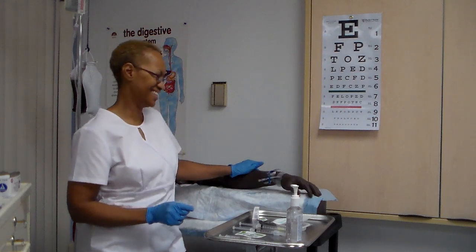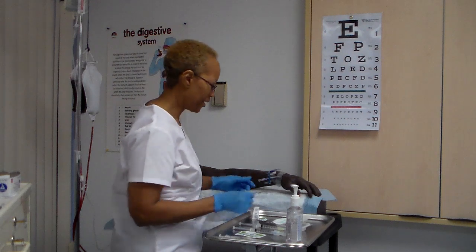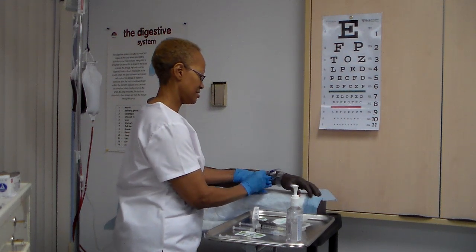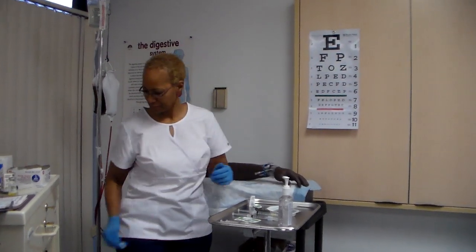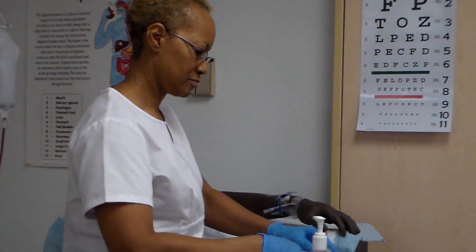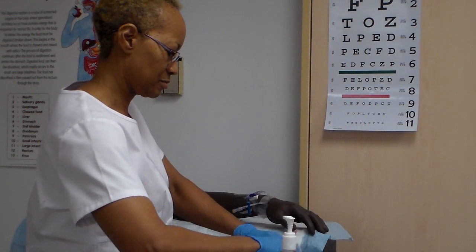Administer medication. Clean lock injection port with antiseptic swab. Okay. Insert syringe containing normal saline into injection port of IV lock.